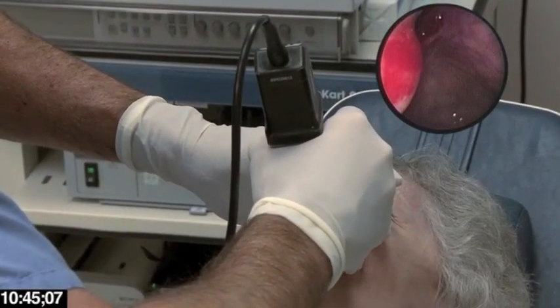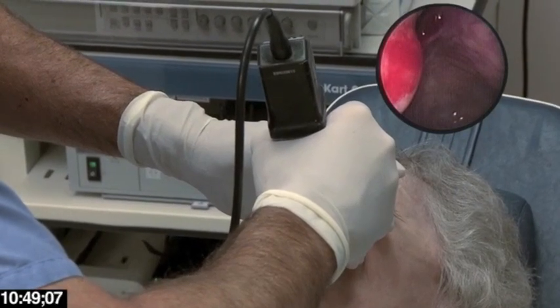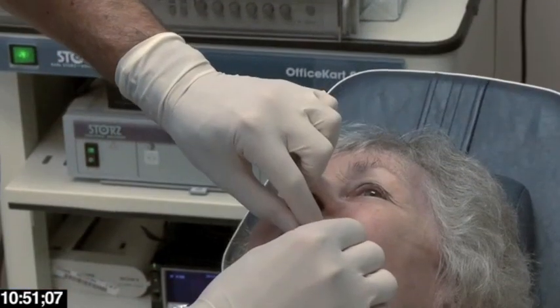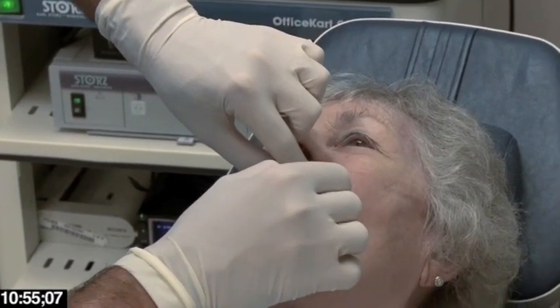Looking back up, we now have a nice wide ostium — significantly improved from before. Gently retracting the trocar sheath, and we're done with the first side already.